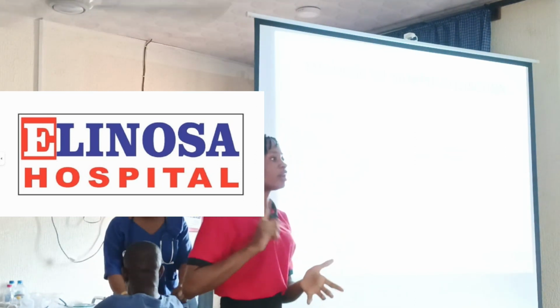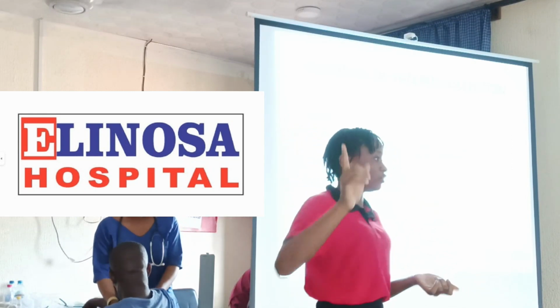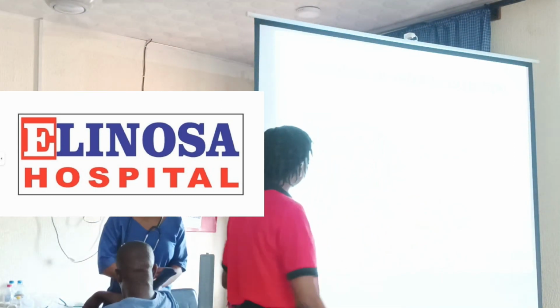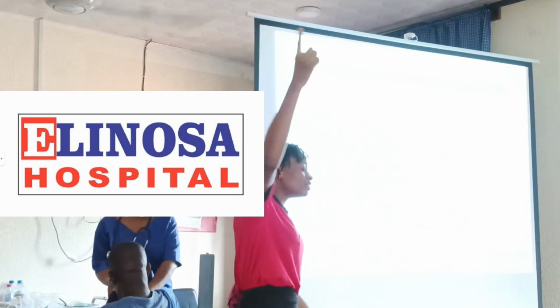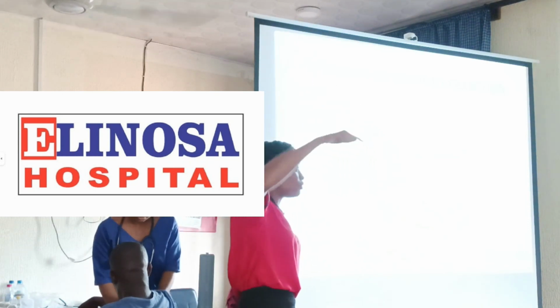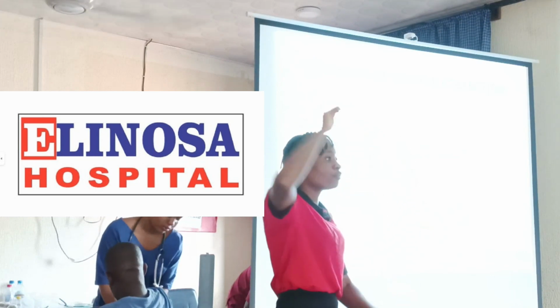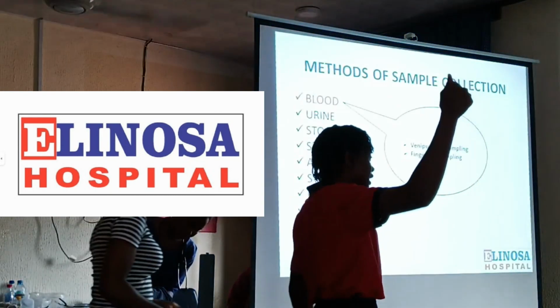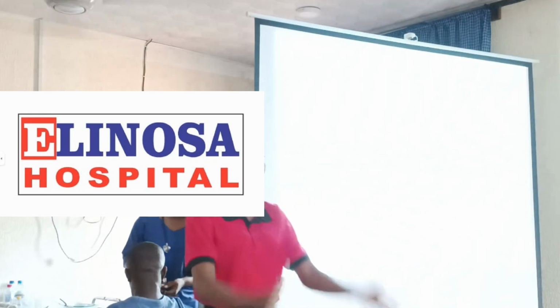Now we have 24 hours urine. For example, the patient comes in by 8 a.m., you give the patient a container and ask the person to pass out all subsequent urine from that time till tomorrow, that same time. You tell the patient to pass out all the urine from that day till the next day up to the time the patient came in, 8 a.m. till 8 a.m. the next day. 24 hours urine is to check for kidney problems.